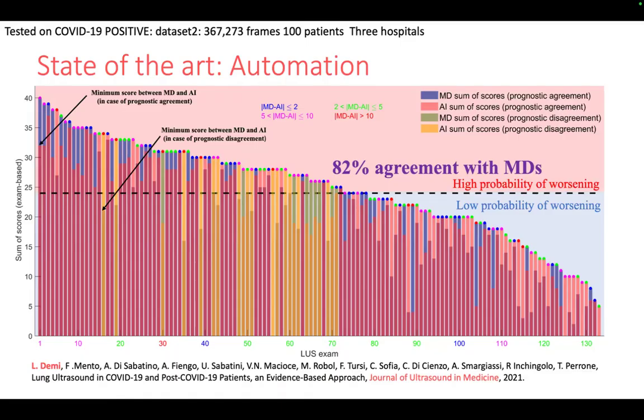And you see that they were in agreement in 82% of cases, meaning that these systems are useful as a support tool for clinicians, but they will be failing, in this case, in 18% of cases. And so, on the other hand, it means that these systems can remove the load of the analysis in 82% of cases and limit to 18% of cases the workload to the clinicians. And that's why explainability is important, because the clinician has to see why a certain call has been made.